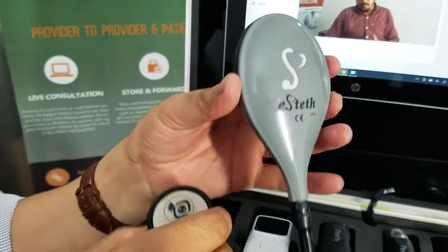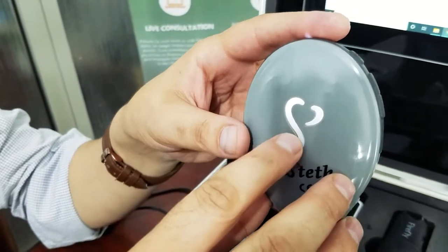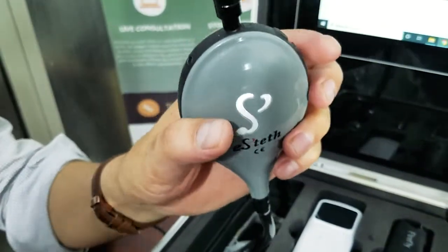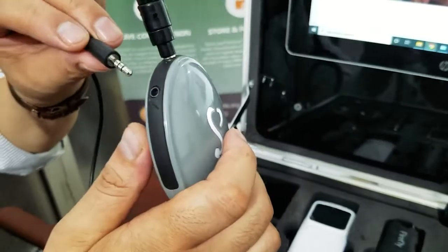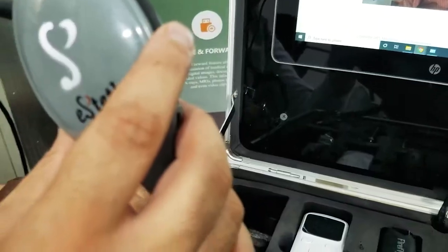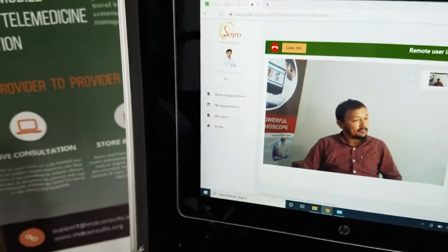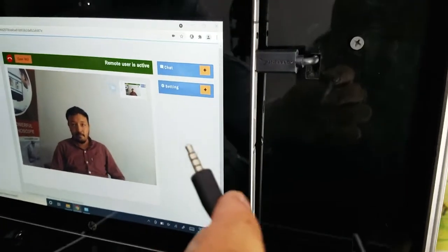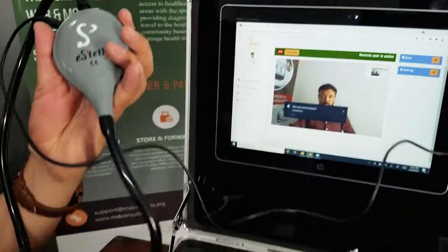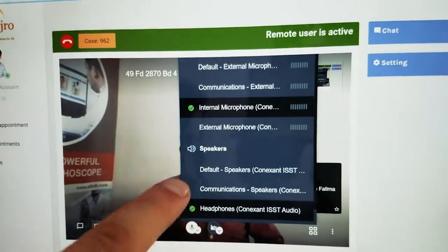Your digital stethoscope can also be connected with the Sojuro software for transmitting heart and lung sounds. There are two Aux cables that can be connected — the top one is for the headphones, so the remote health provider can listen to the patient's sounds, while an Aux cable connected on the side slot goes into the tablet, allowing the stethoscope sounds to be heard by the physician at the remote end.